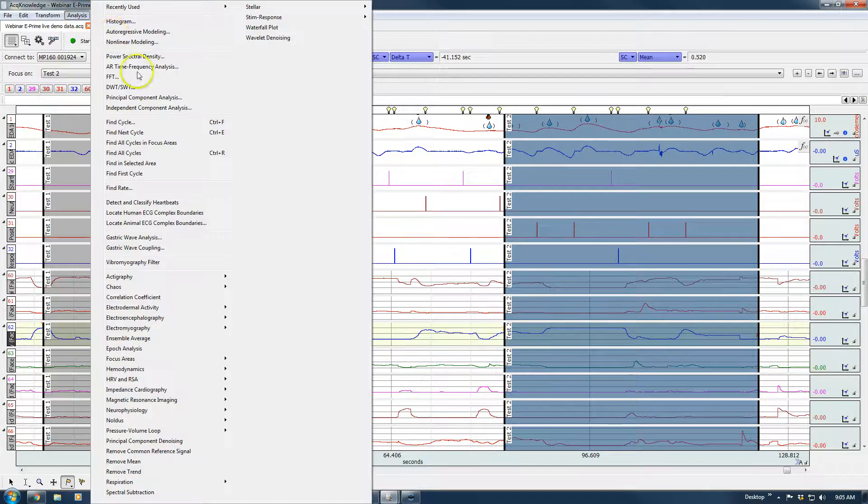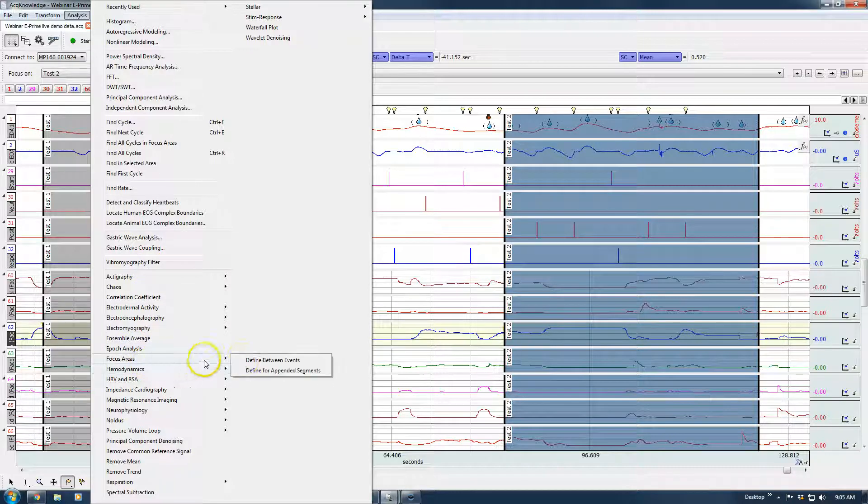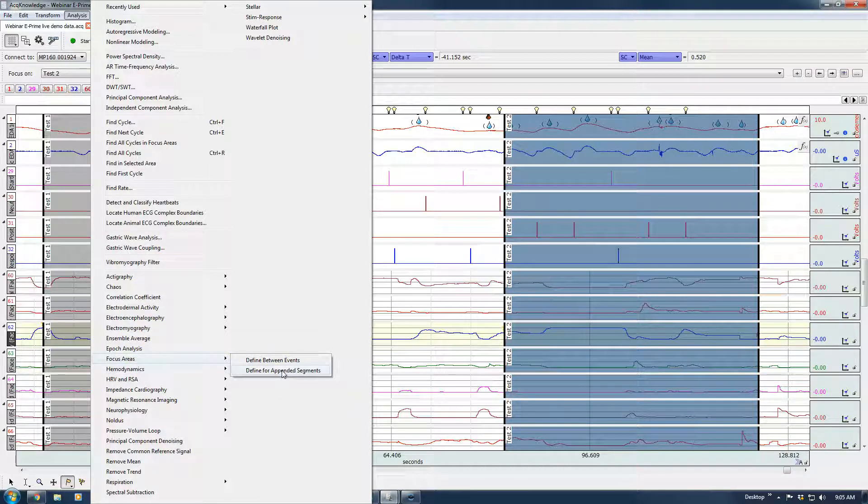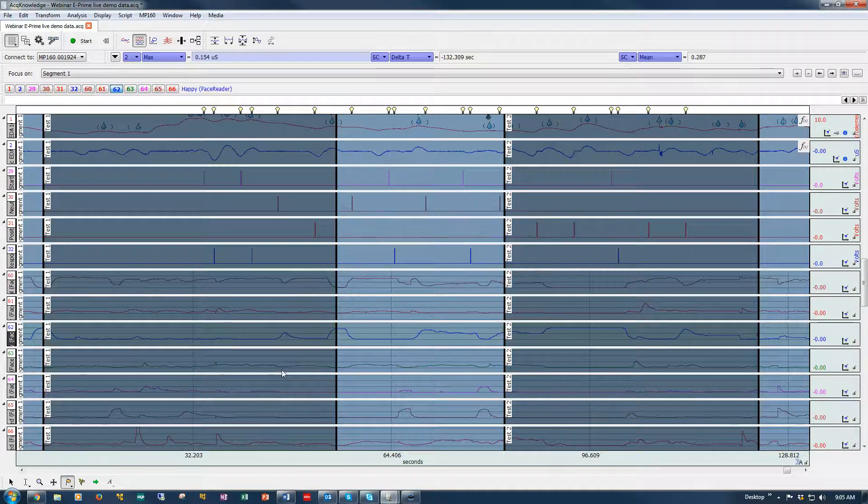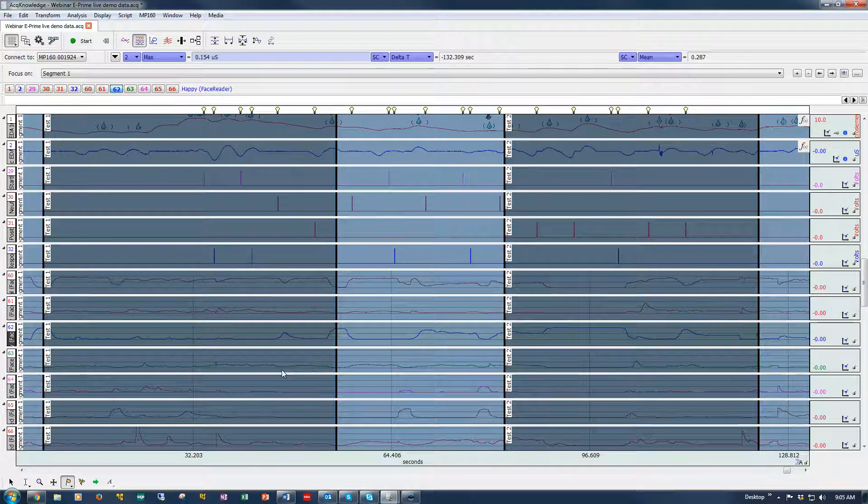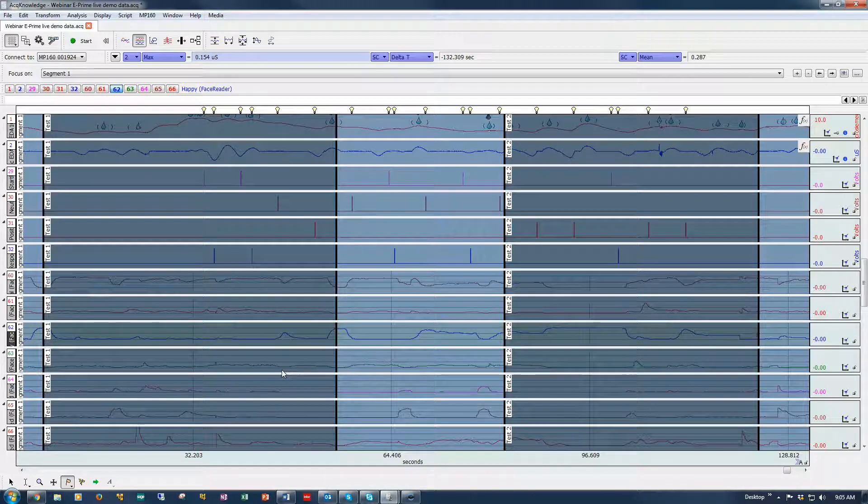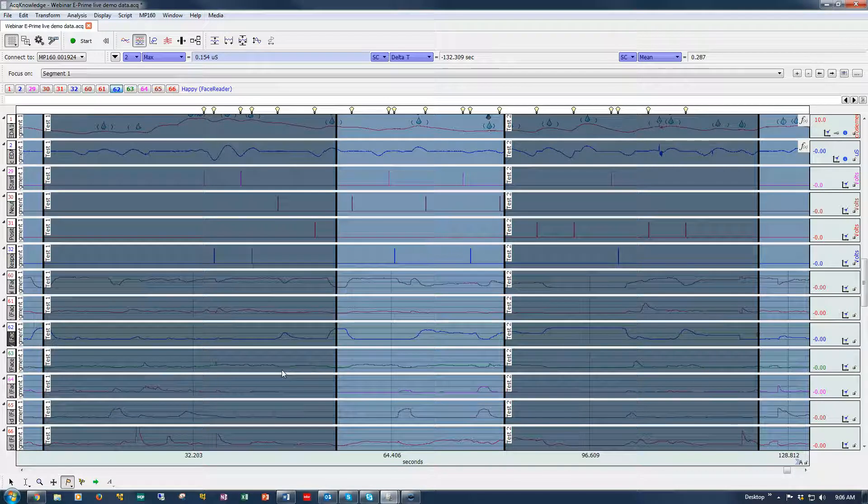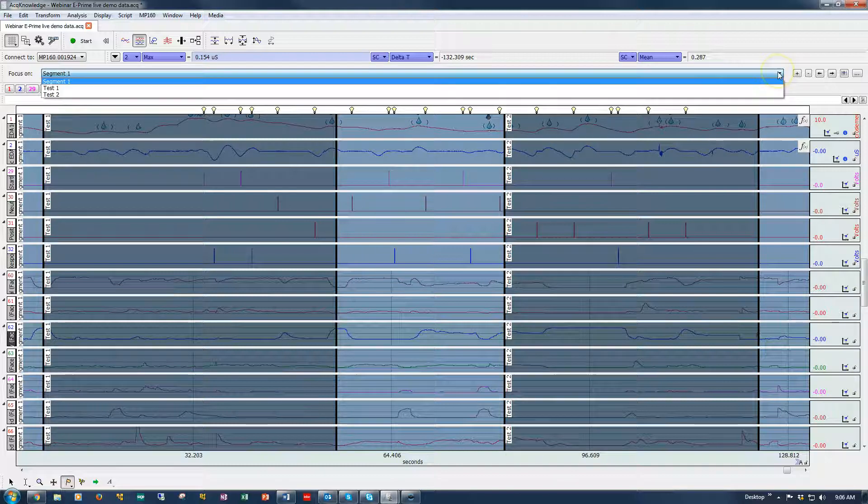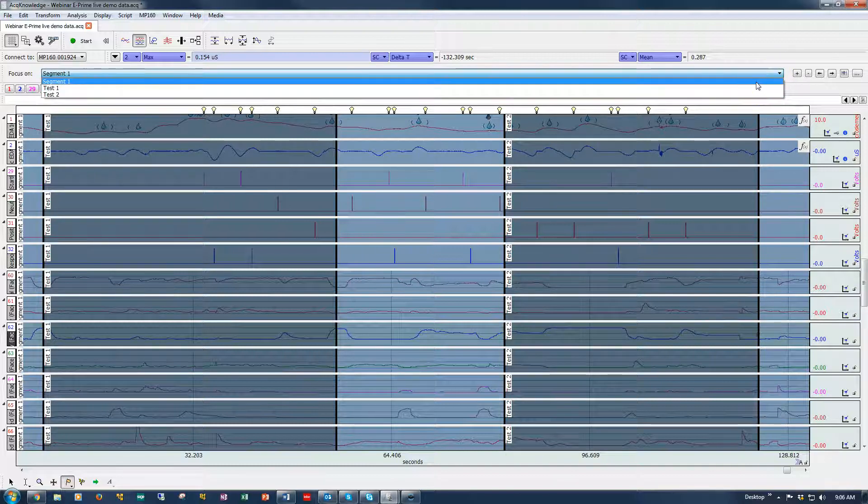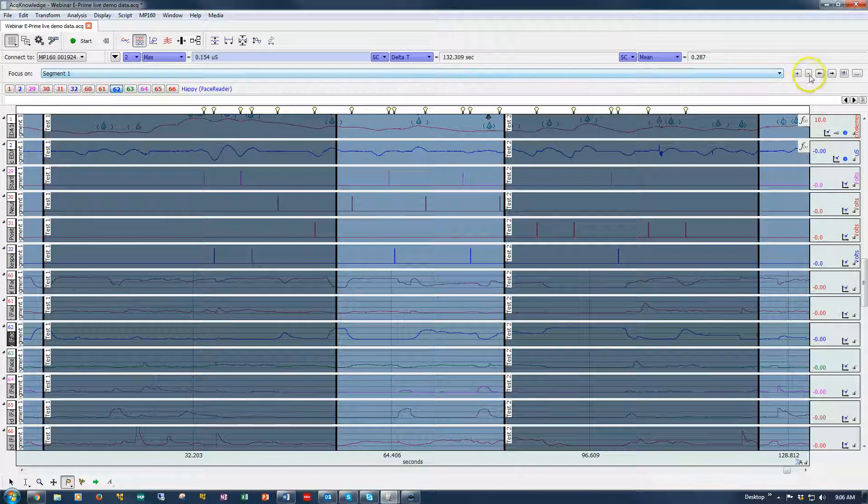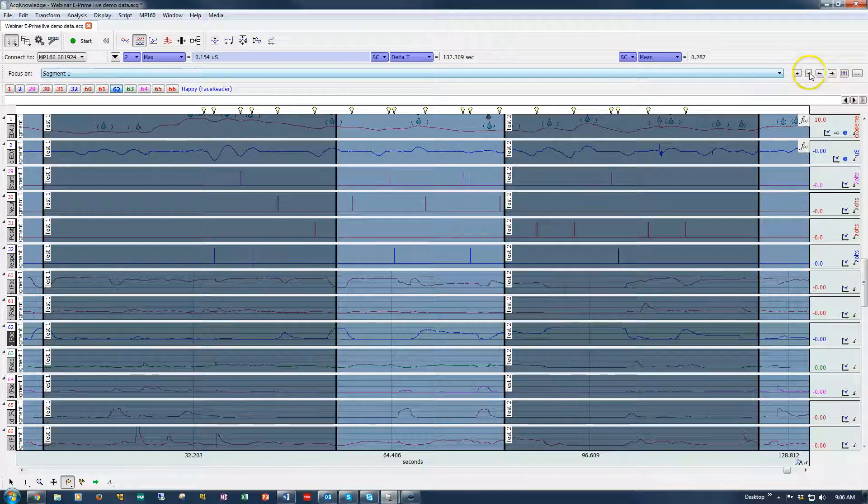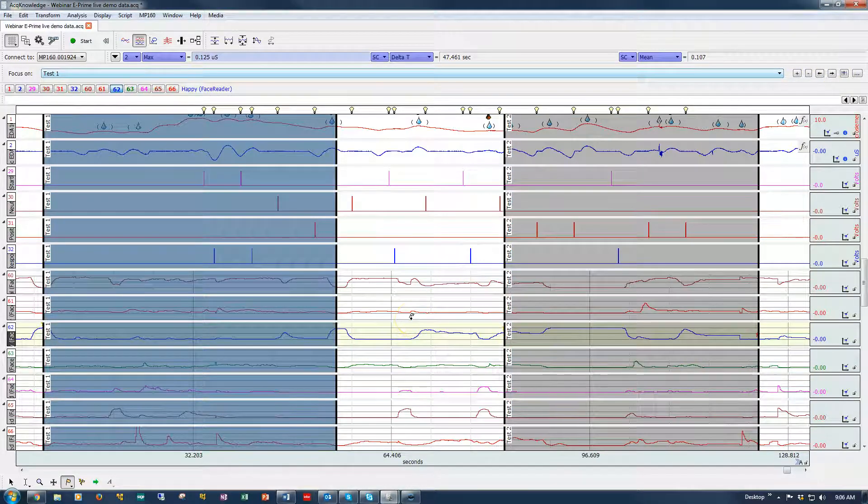Now, you may have noticed when you come into here, you can also define between appended segments. And in my case, I only have one segment in here. So it's created one master segment. But if you've broken your recording up into different segments by using the append mode, then for each segment, the system will create focus areas for you. And then there's the list of focus areas. And if I want to get rid of one, I can select it. And there we go. We're back to where we were.